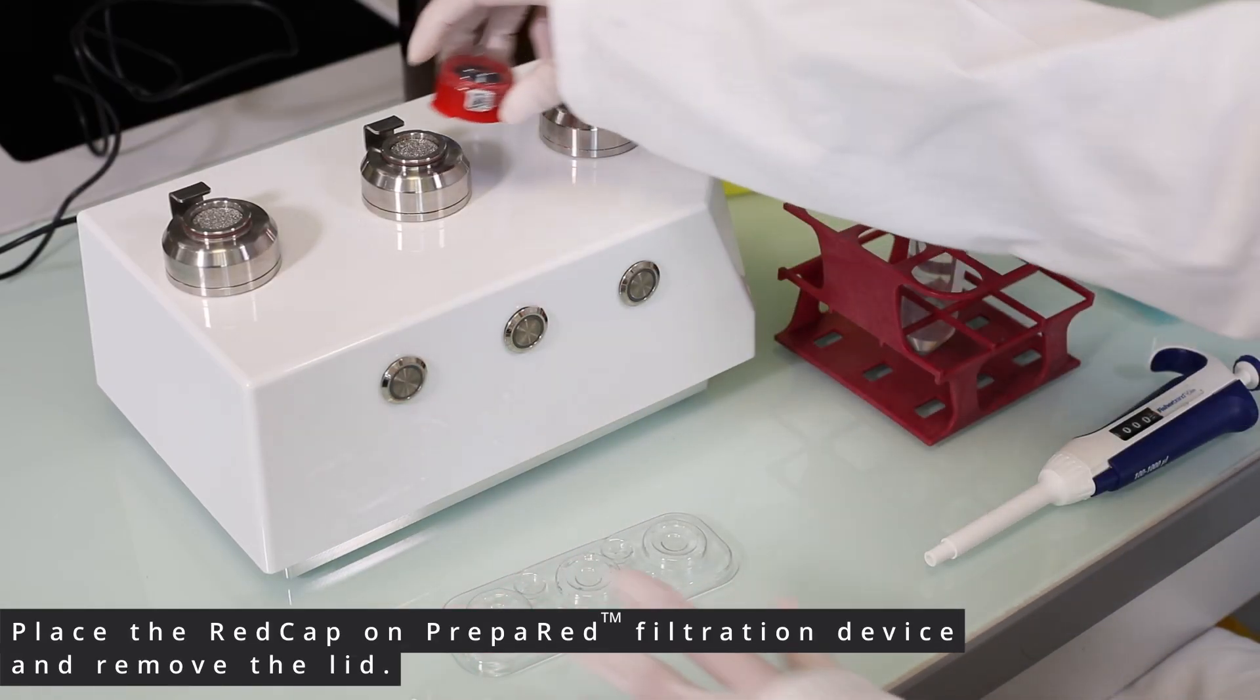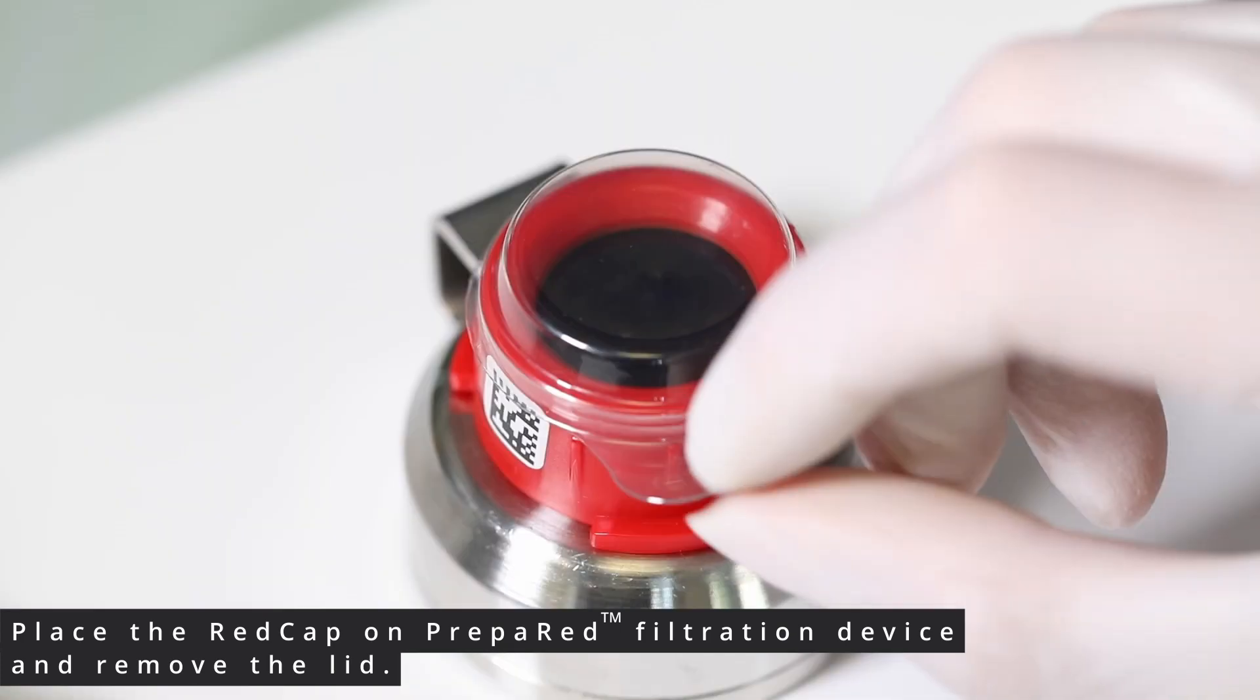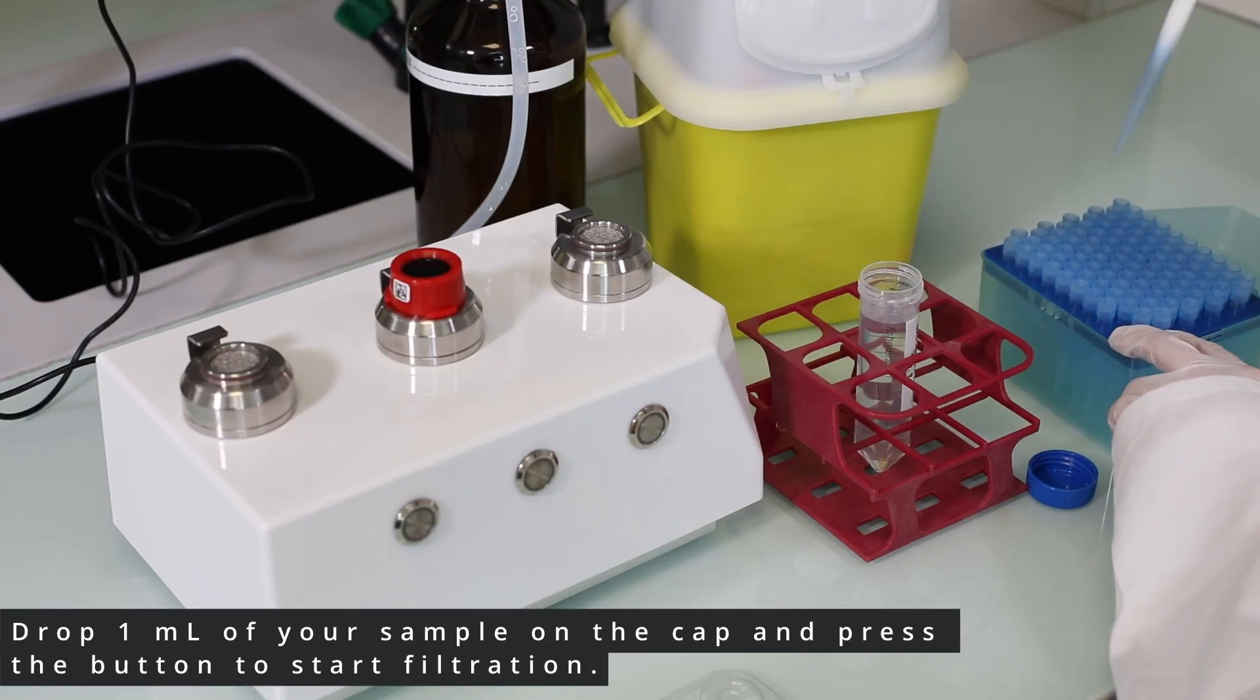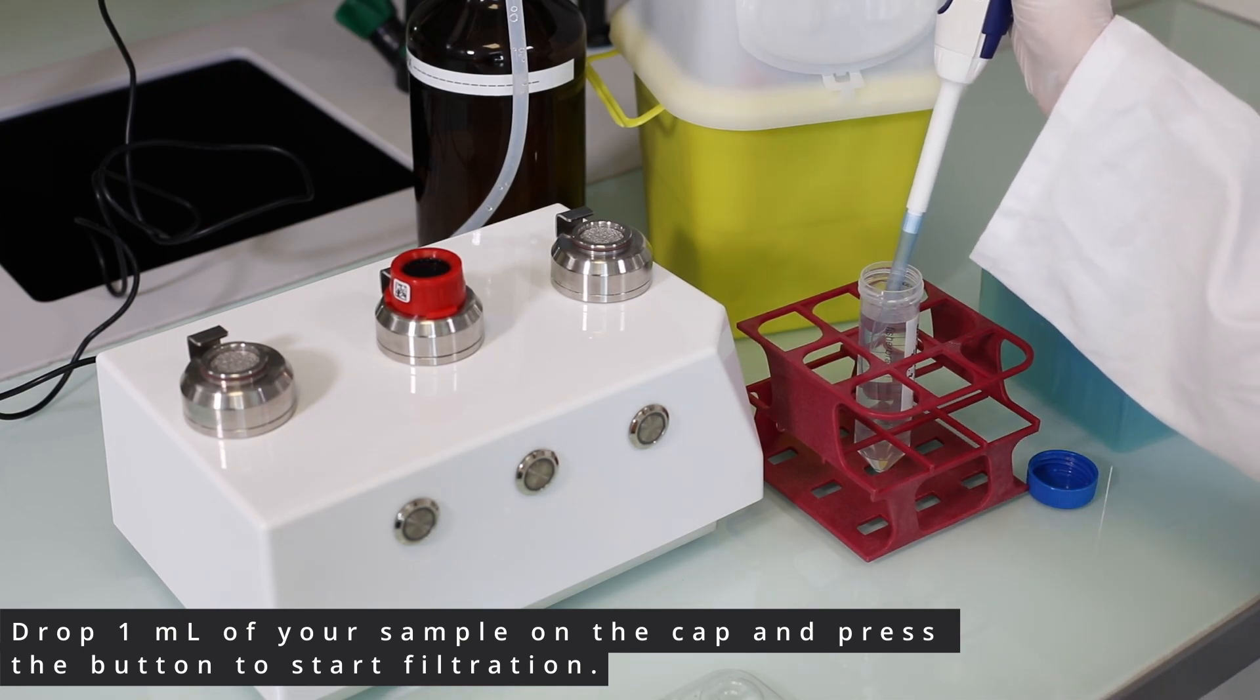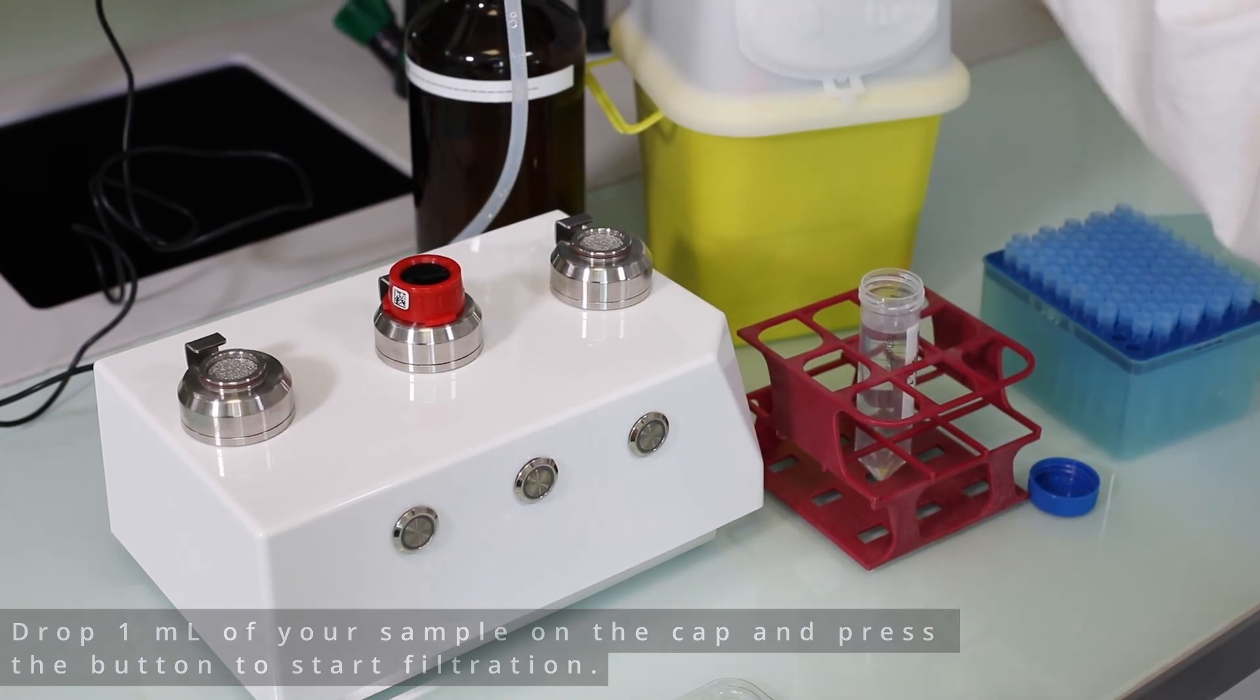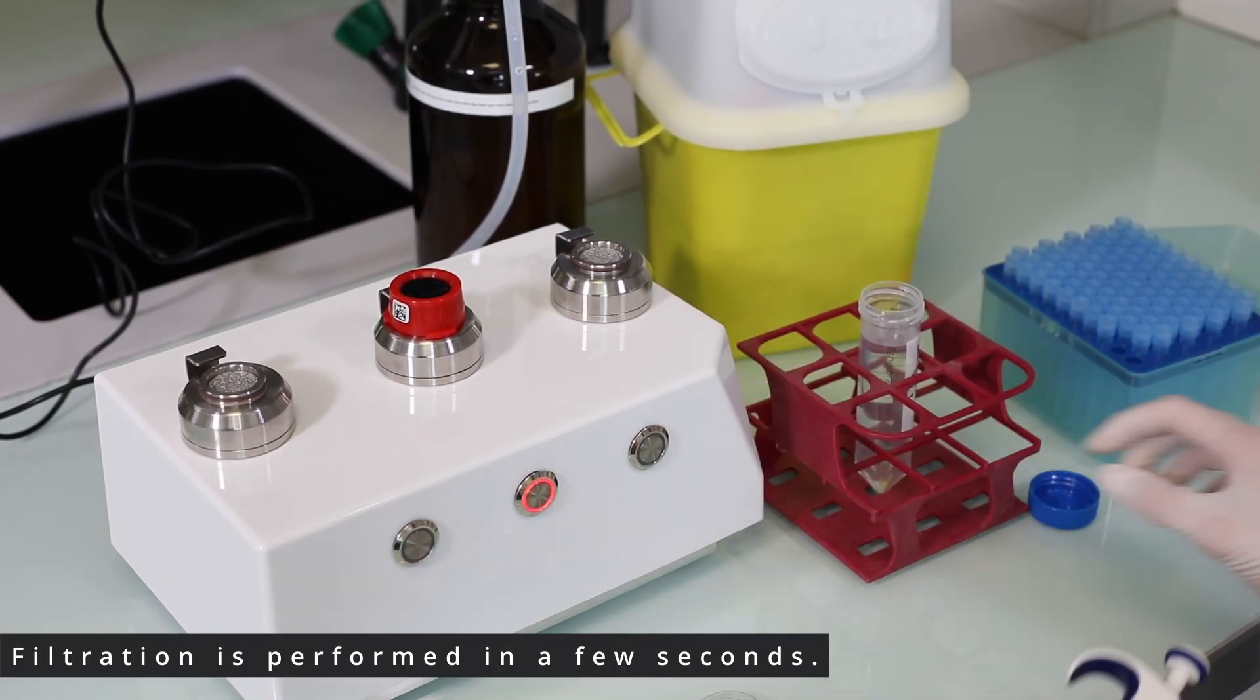Place the red cap on the Prepa Red filtration device and remove the lid. Drop one milliliter of your sample on the cap and press the button to start filtration. Filtration is performed in a few seconds.